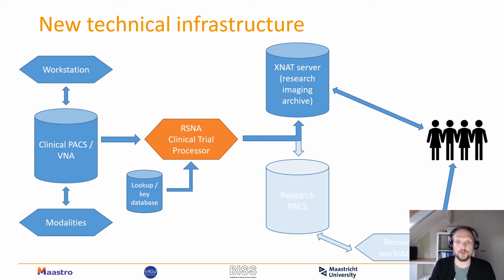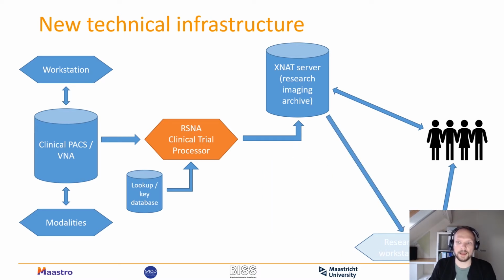So that's part one, what we're currently in the process of transitioning, let's say, from that network drive towards this XNAT server internally. So this is the current setup, what we have in a hospital. And maybe in the future, we can link that XNAT server directly to the research workstation. However, that fully depends on the research workstation capabilities as well.